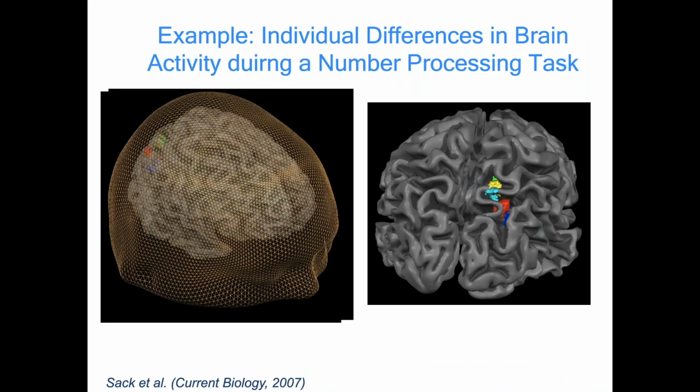And of course, this in the motor system seems maybe a bit boring, because you could have found that spot also by just hunting, by trial and error, by stimulating different areas across the motor cortex until you find the finger twitch, and many people do that, and that's fine. But of course, if you're outside the motor system and you don't have a direct observable effect of your TMS, then this fMRI-guided neuronavigation, as we call it, is very, very vital.